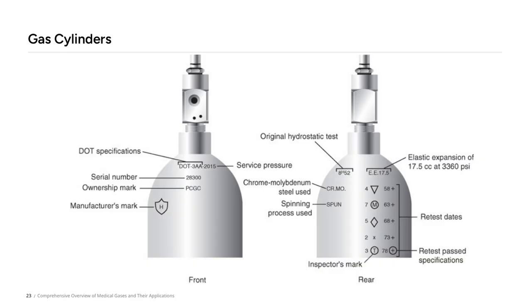Understanding how these cylinders work and their safety features helps us appreciate their vital role in providing effective patient care. Overall, gas cylinders are an essential part of the medical gas supply chain, supporting everything from routine treatments to critical life-saving interventions.